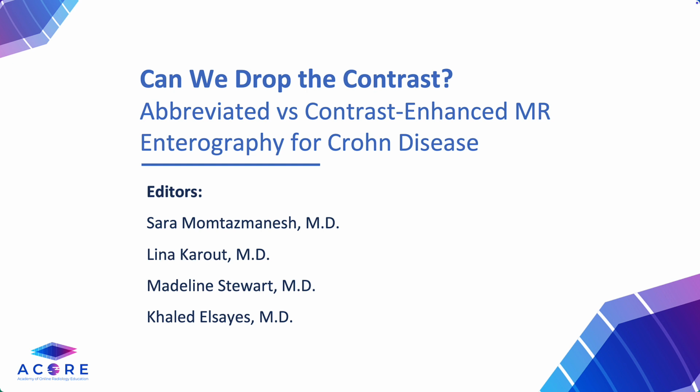Today, we are discussing MR enterography in Crohn's disease, and specifically whether intravenous contrast is still necessary or whether a shorter, contrast-free protocol can give us the same information.